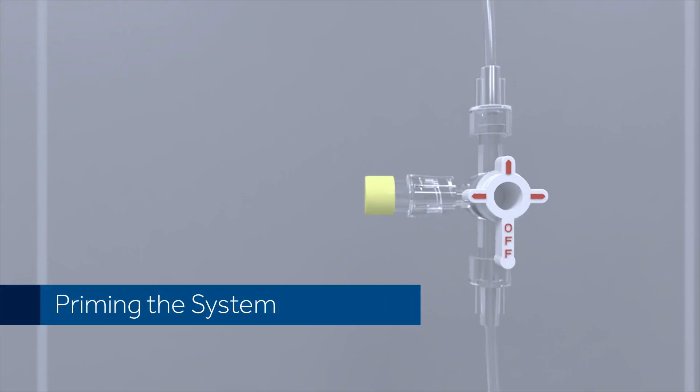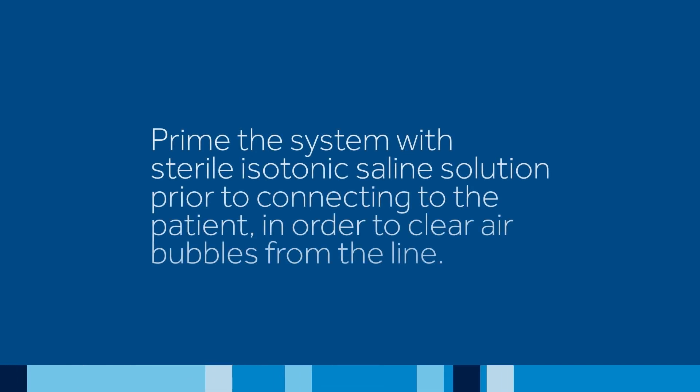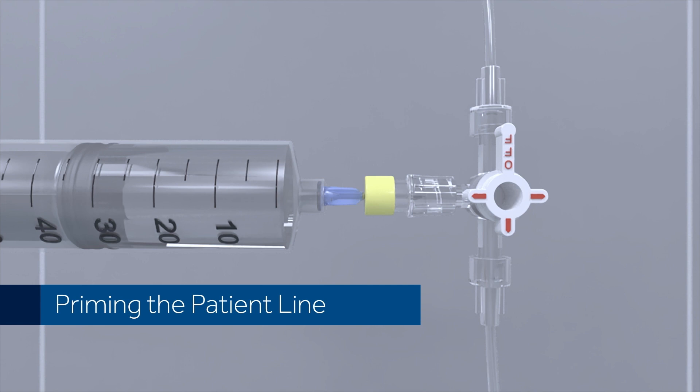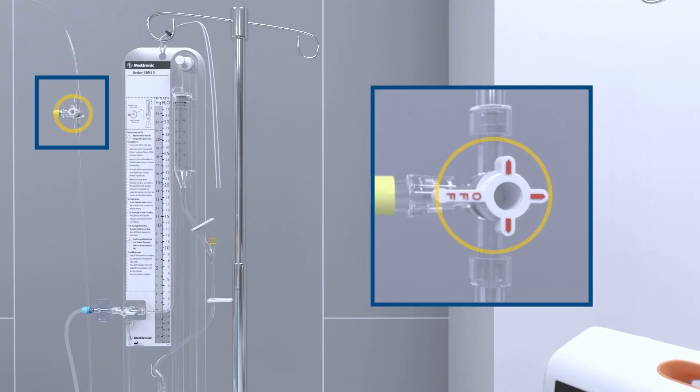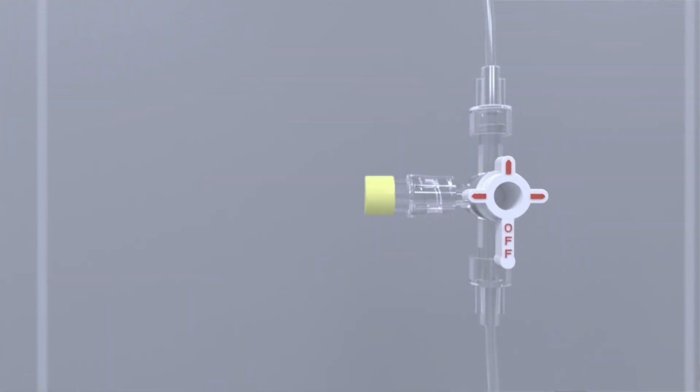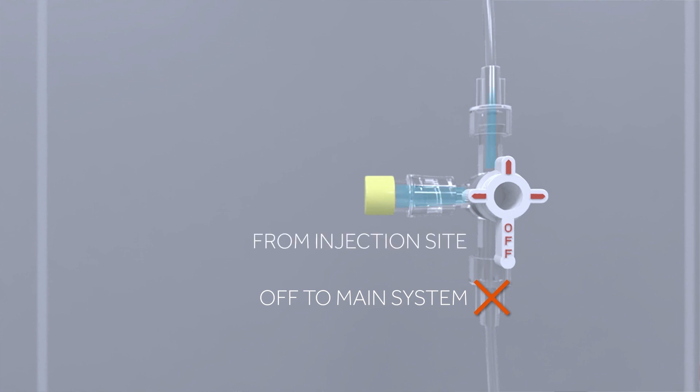Priming the system. Prime the system with sterile isotonic saline solution prior to connecting to the patient in order to clear air bubbles from the line. Priming the patient line. Begin by rotating the patient line stopcock handle inscribed with the OFF indicator toward the main system stopcock. In this position, saline will flow from the patient line sampling site to the short section of patient line tubing only.